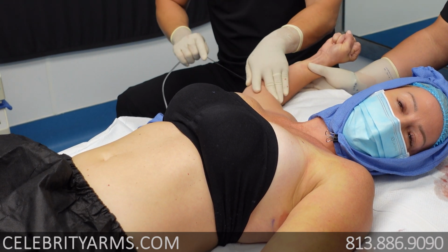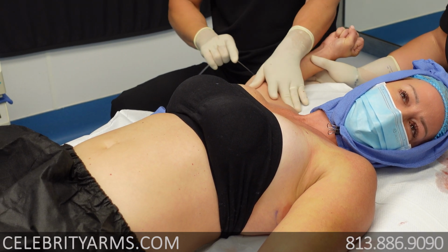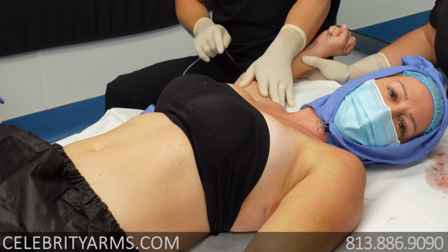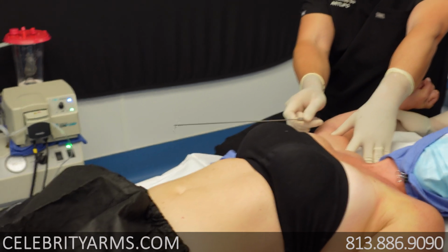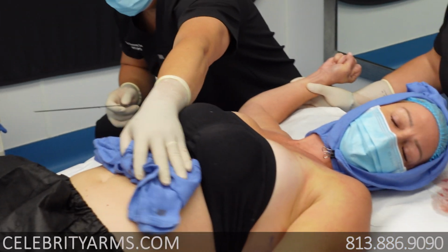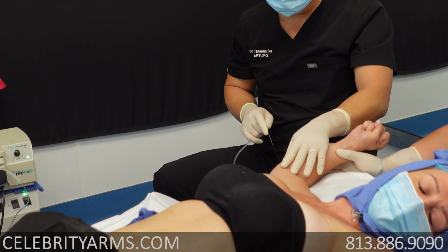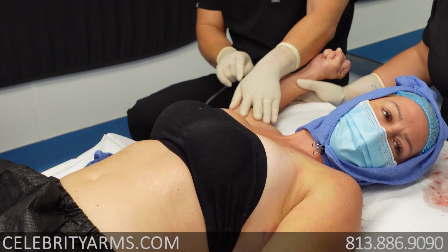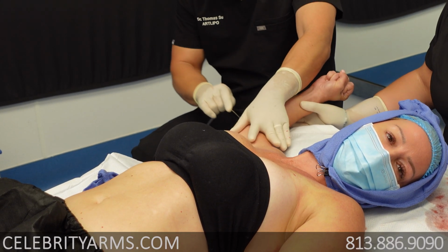Okay. You really don't feel much as the tumescent goes in. Very minor pinching, but very tolerable. So here, if you can just show them this, Rochelle, turn it on. Can you see that, Rochelle? Okay. So for the audience out there, that little squirting, this little sprinkling, that is the tumescent fluid being injected into the fat layer, which is what numbs up the fat for us to be able to remove it.